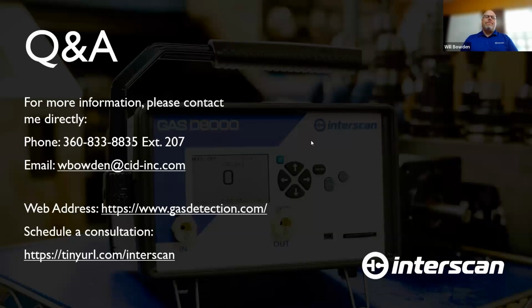Each module can detect a separate gas. For example, if you had ethylene oxide and hydrogen peroxide in one room, you would have two different sensor modules for those. You'd have one for the ETO, one for the peroxide. So that's two modules right there in that room. If you have another room that has the same configuration, that'd be two more modules. So to answer your question, each module is set up for an individual specific gas and a range. So if you want to do different gases, you can do that.